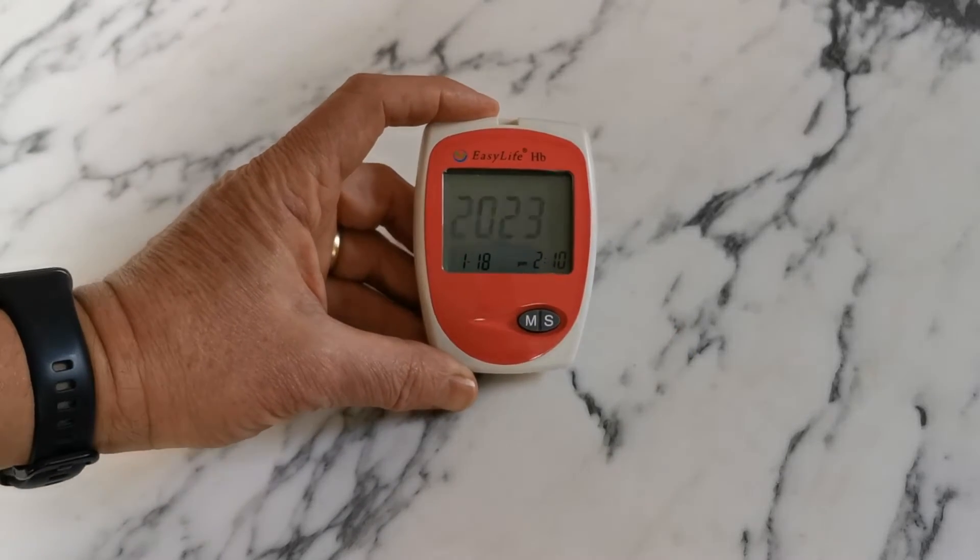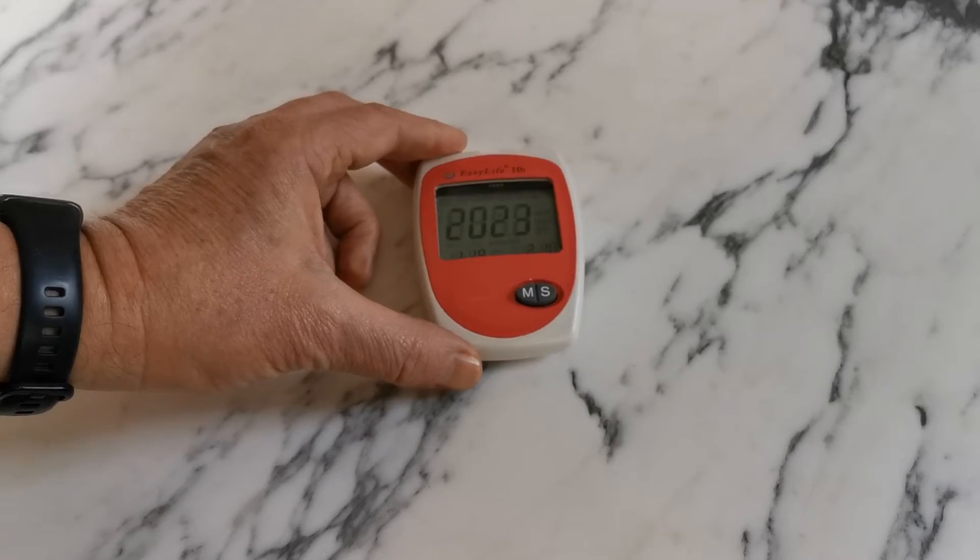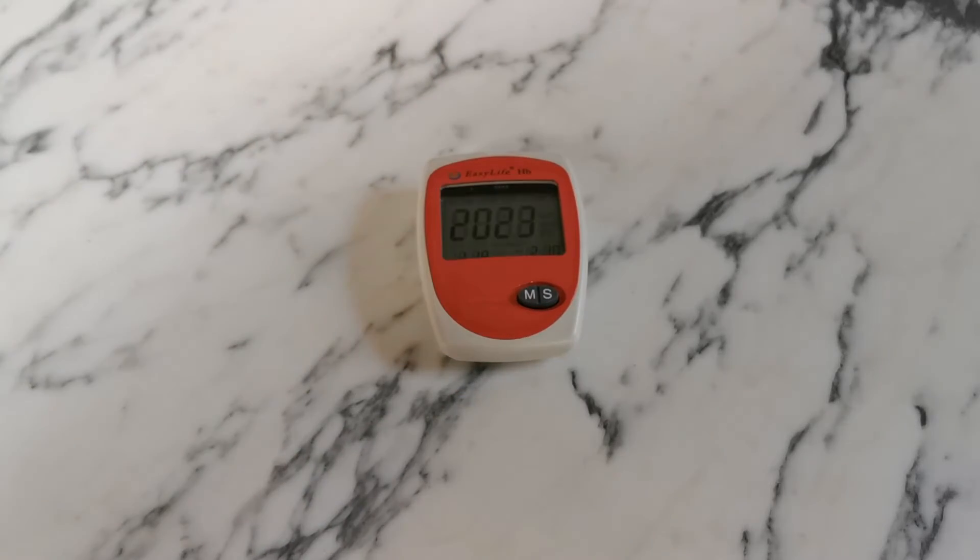When you're happy that all values are correct, even though they're still flashing, just leave it — don't press any more buttons. In 10 seconds it will power down and retain all the year, date, and time in memory, which can then be recorded alongside the tests you perform with this meter.